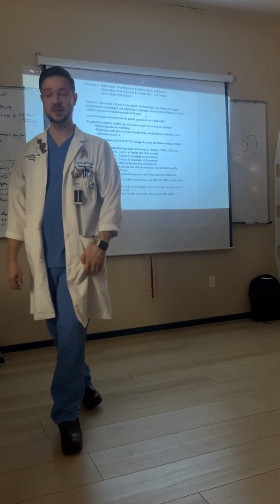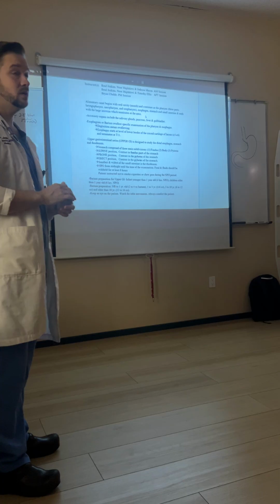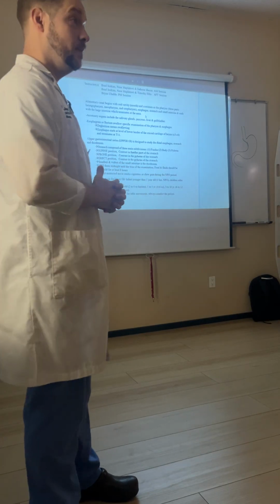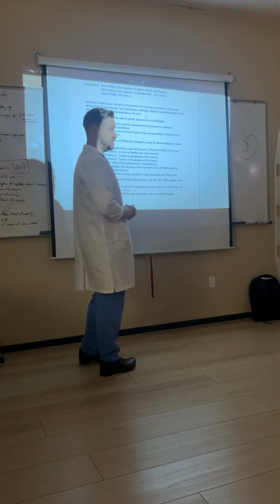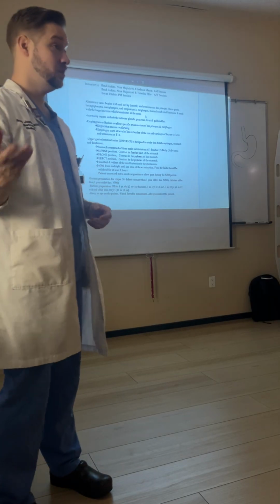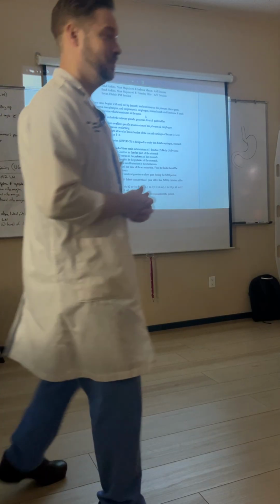And for fluoroscopic exams, as with any exam, but especially for fluoro, you want to make sure that you ensure the patient's comfort. They're going to be doing a lot of moving on this table. They are already in some kind of distress, probably, right? They're in the hospital for a reason. If they have really bad abdominal pain or they're post-surgery, we want to be sure that we're helping them to be comfortable during this exam, okay? So that we can get the exam completed as efficiently as possible and get them back to their comfortable bed. Okay? Questions on any of that? Anything to add? All right.